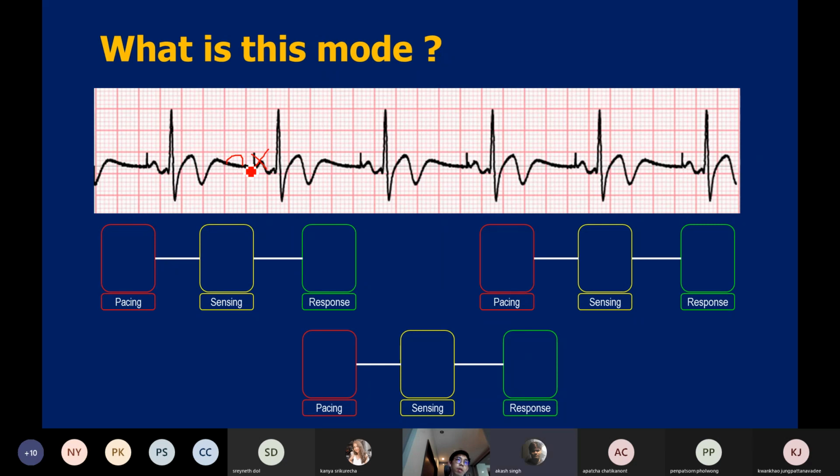From the heart. What abnormal signal do you mean? Like the morphology of the P wave, something we have problem in after implanting the pacemaker, in case any complication happens in the heart. So in that case, it will trigger, right? Like it will sense the incoming signal.